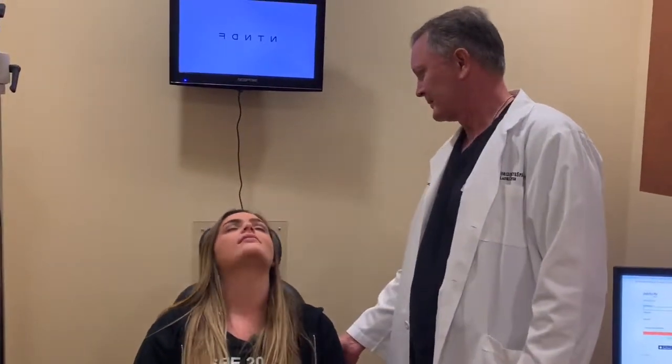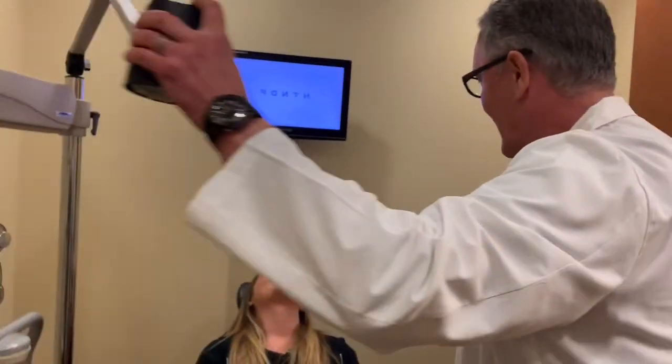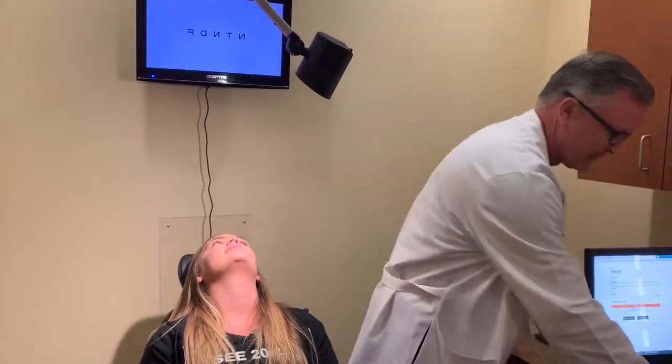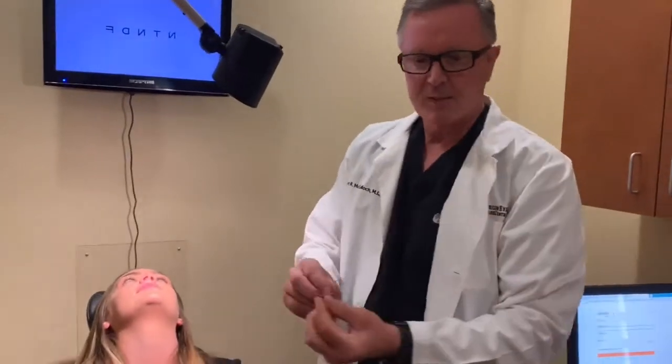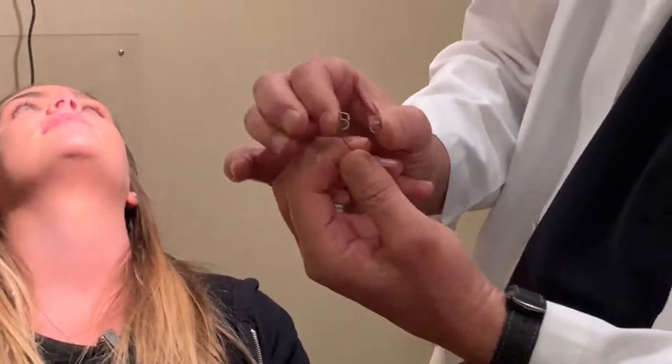Brooklyn, I'm going to tilt you back. Brooklyn's tilting back, and because I'm growing up, I'm putting on my progressives. I'm going to add more light, which is always the easiest thing to do — as we do light, it's just easier. My preferred speculum is a type that has a finger grab, as well as a very light speculum.